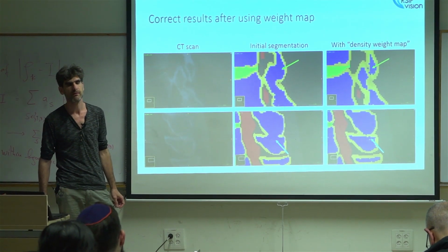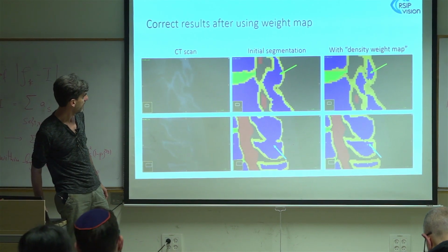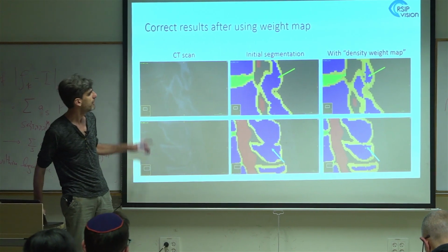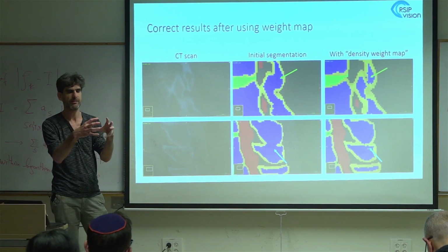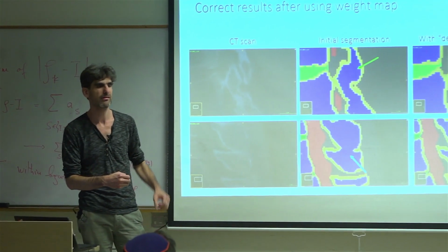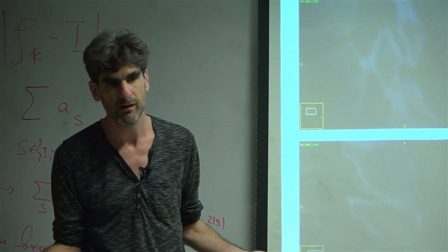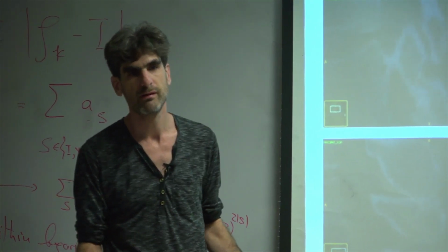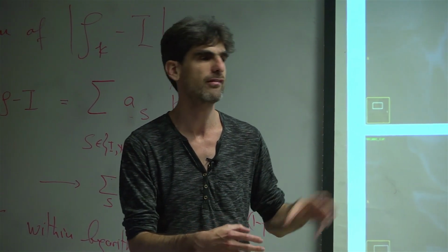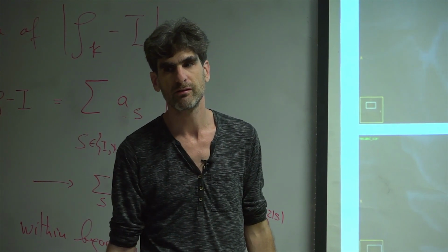What's the size of the pixel here? Good question. I don't know. Maybe it's a millimeter. I can't tell. But this algorithm is running on a downscaled version. So this might be 2 millimeters already, because again, it won't fit at the full resolution into the GPU, and it will be too slow. So this is only running on a downscaled version. Right now, it's not feasible to do this for the whole thing in reasonable running time. So it's just the first stage.